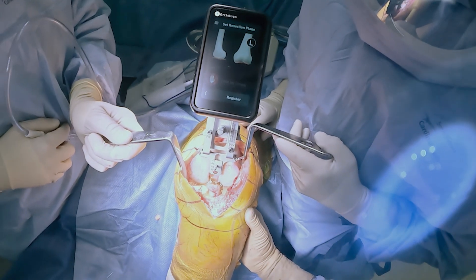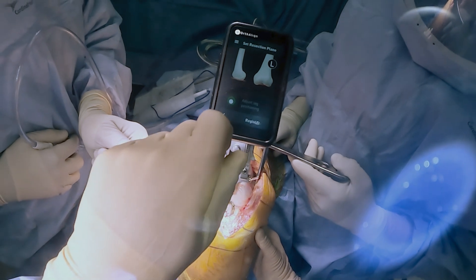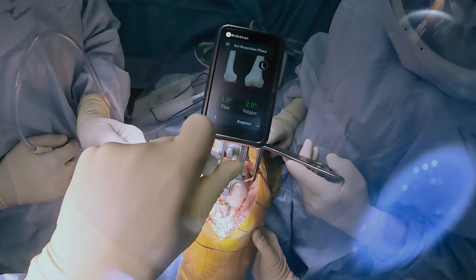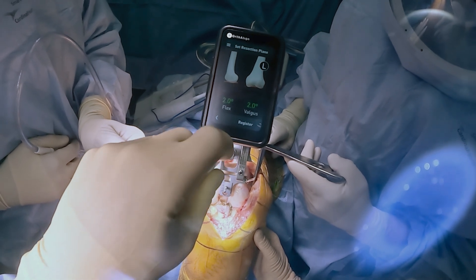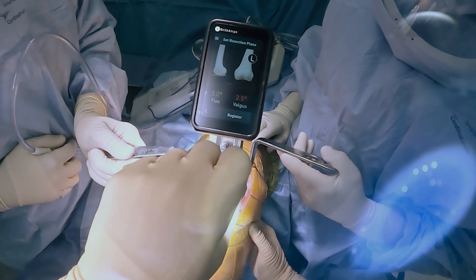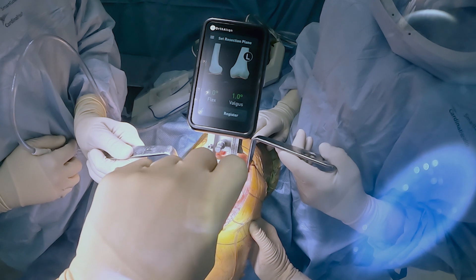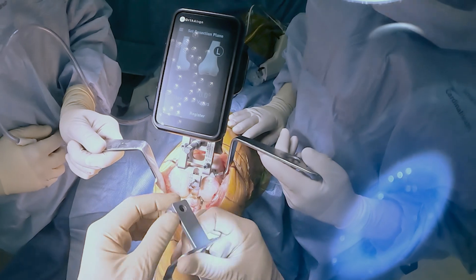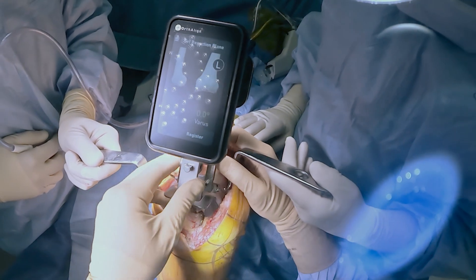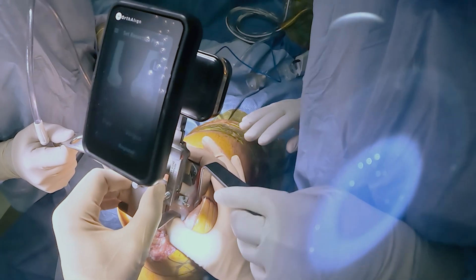Here we are after registering mechanical axis and you can see how easy it is to use. I'm adjusting the varus valgus angle. I'm personally using a neutral mechanical axis with a three degree flexion according to the AP bow. This takes me approximately 20 to 30 seconds longer than manual instrumentation. However, it's very easy to use and the computer system makes it a very friendly user interface. As you can see here, I'm setting my depth of resection, which is approximately nine millimeters. This is approximately four to five minutes into the case, which is average for me.